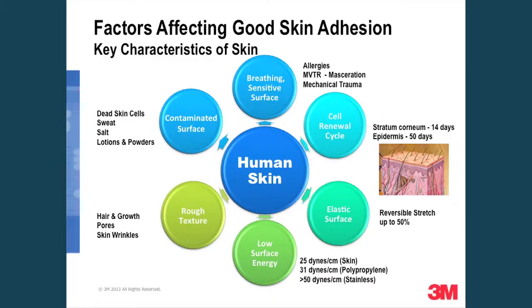It's very similar to trying to stick to untreated low-density polyethylene or polypropylene. Things don't like to stick to skin, and so you have to make sure that you select a product that's going to stick well to that low-energy surface without a lot of pre-treatment, other than soap and water.